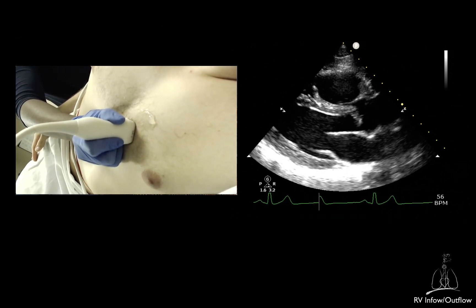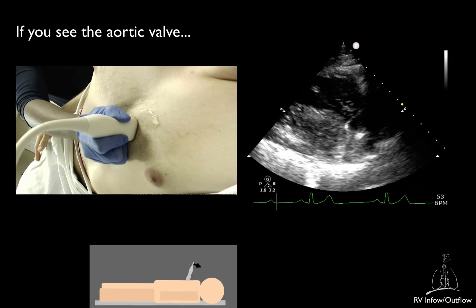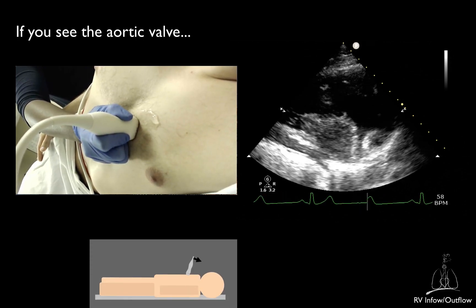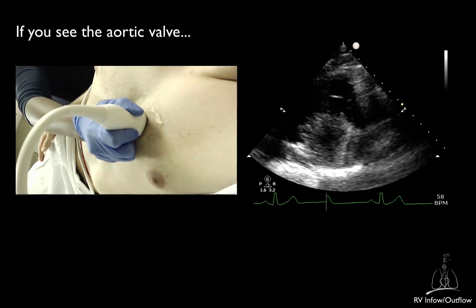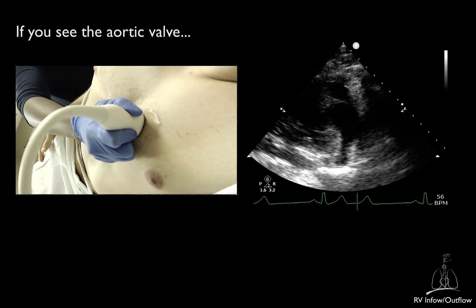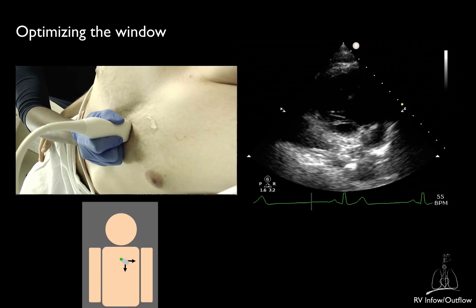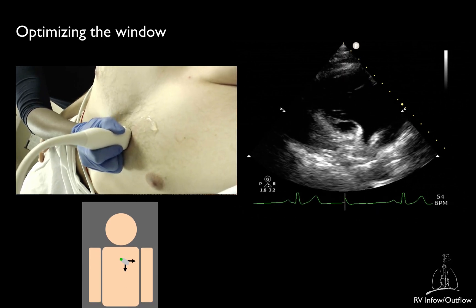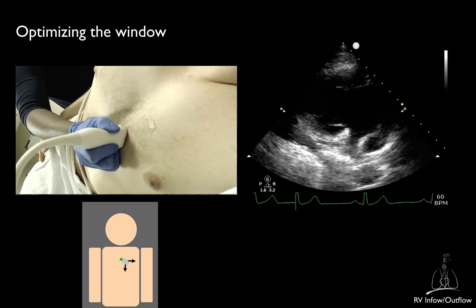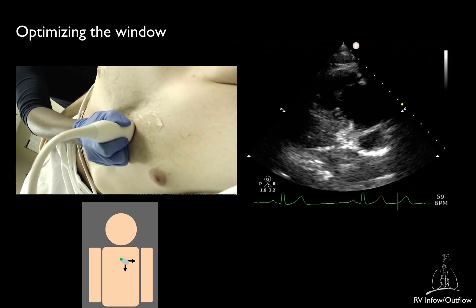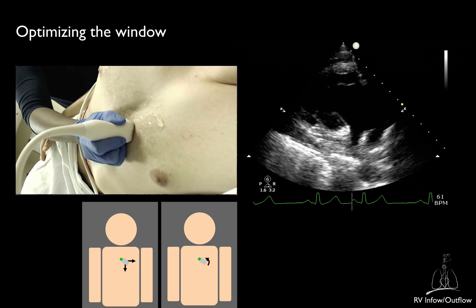You should not see the aortic valve in the parasternal right ventricular inflow view. If you still see the aortic valve, you should keep tilting the footprint looking even more downwards. Tilting the ultrasound beam downwards and anteriorly often results in directing it against a rib. The acoustic window can be optimized by sliding the transducer slightly laterally, or to a lower intercostal space or within the same intercostal space. Infrequently, you may have to rotate counterclockwise to get a PSRVI without the LV.